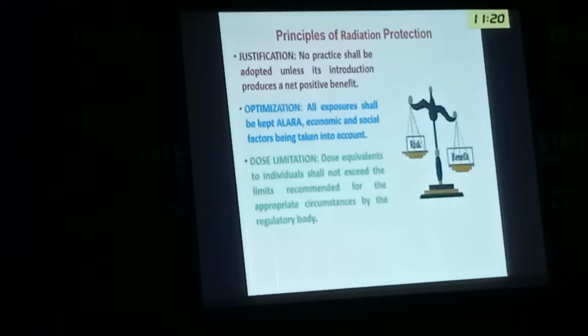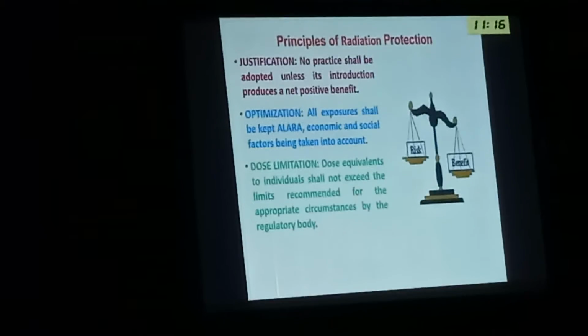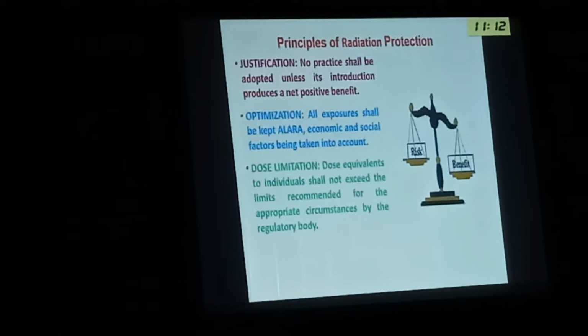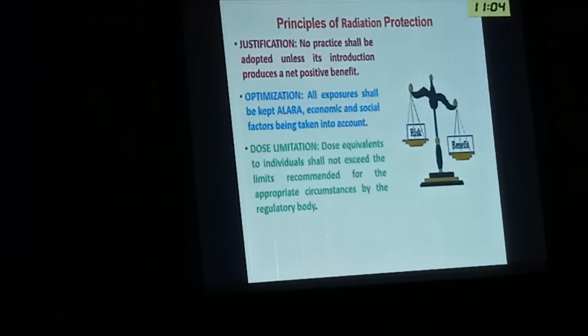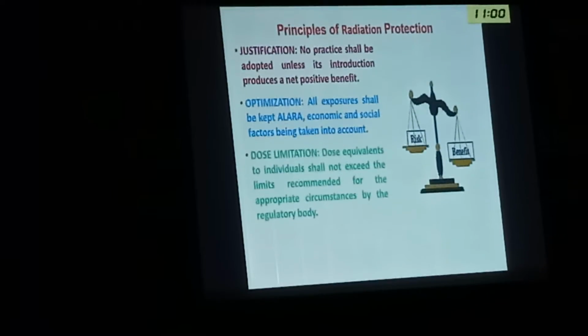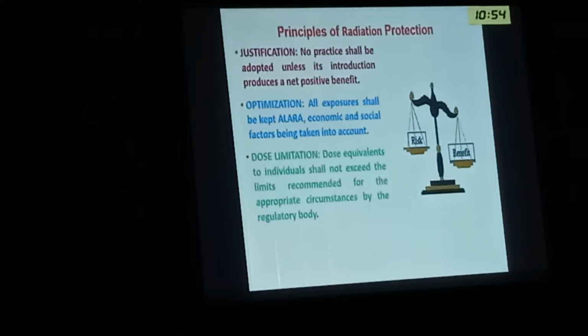That means suppose I can minimize the dose, for that I have to put an extra amount of shielding, so the dose will be reduced outside. But there I also have to consider the economic factors. So I have to optimize things. It is not that instead of just 23 centimeter brick, I will put 30 centimeter or maybe 1 meter brick. Then your cost involvement and all those things will be huge. So I have to optimize the things.